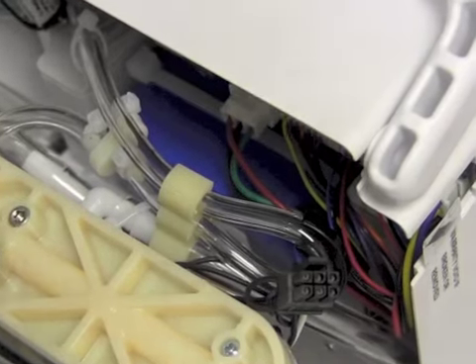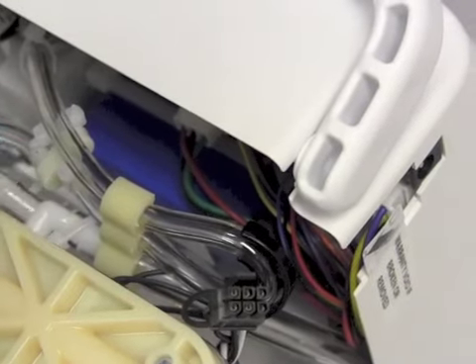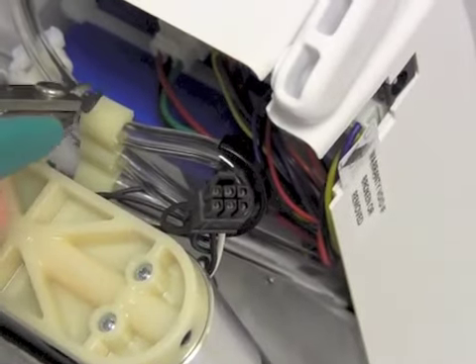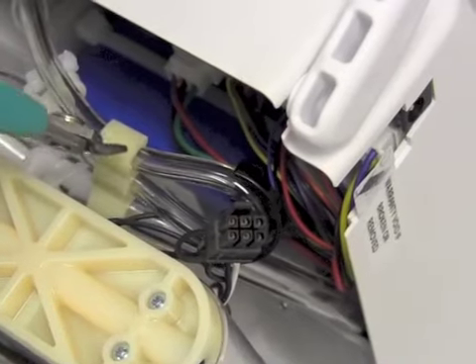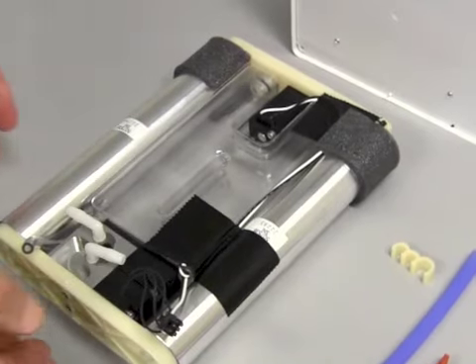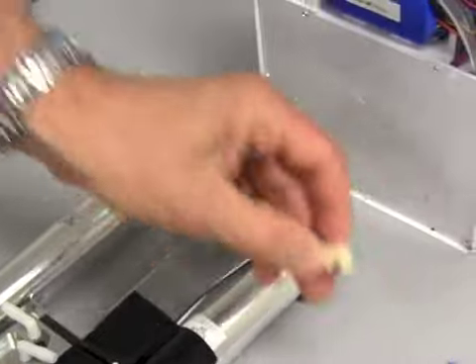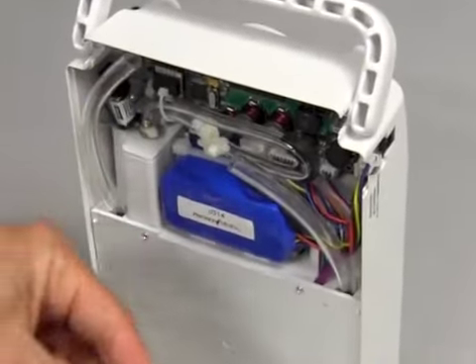I have now cut the wire ties to the 3 Tygon tubes, 1, 2, and 3, and I have pulled the plug off the circuit board. The last part of this step is to take the clip that holds the Tygon tubing in the shape and remove that. This is the sieve bed assembly removed, right? And this is the clip that I took off the Tygon tubing that holds the Tygon in place when it's reassembled.